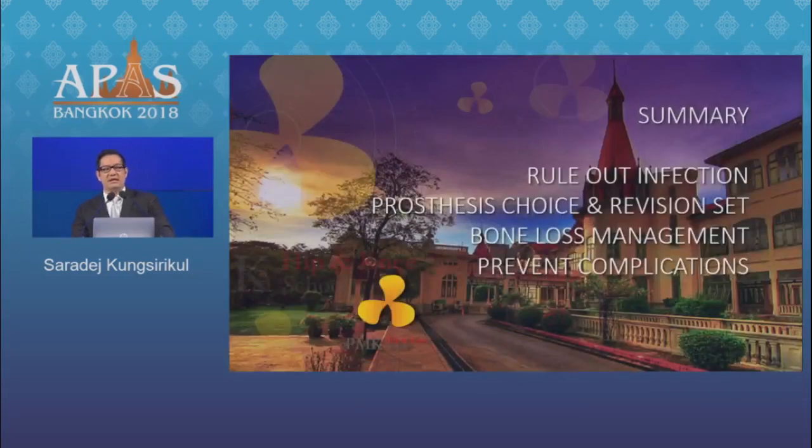So in summary, in this group of cases, you have to rule out the infection first, use the proper implant choice. You have to plan for the bone loss management, and also prevent the other complications that may come. Thank you.